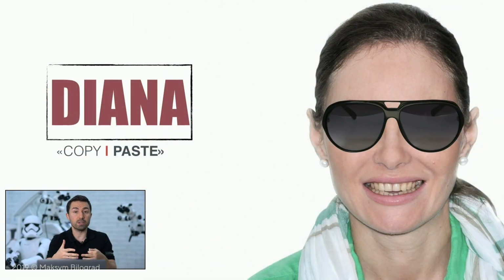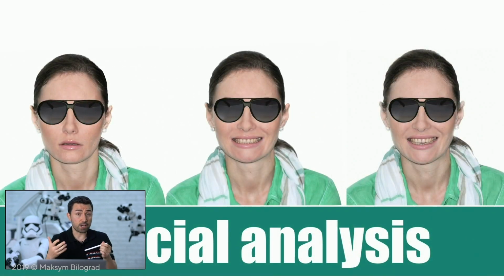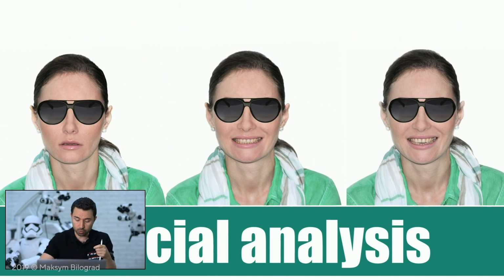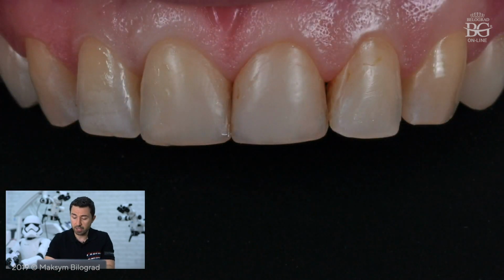She was not happy with the length of her teeth, and she was slightly unhappy with the color of her teeth. As we can see from the facial photos, especially the first picture, there is not enough display of the frontal teeth through the upper lip, which gives you an idea that the central incisors are slightly short. Basically she wanted to make her central incisors longer.